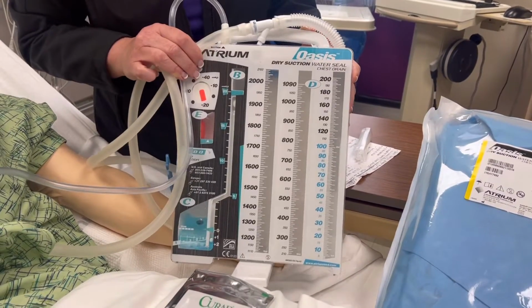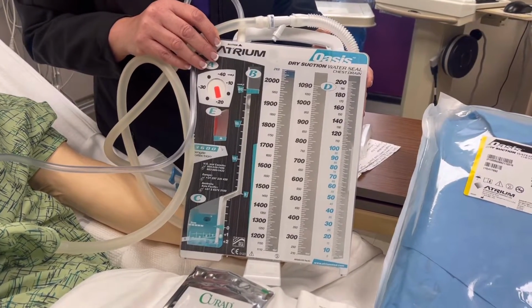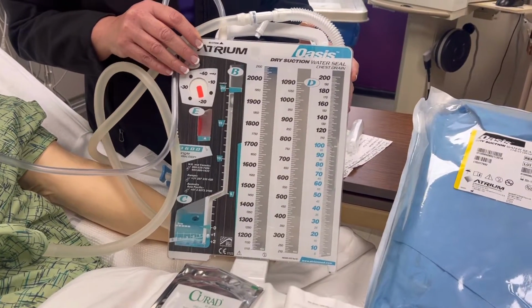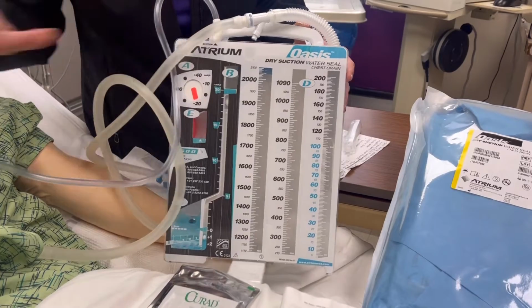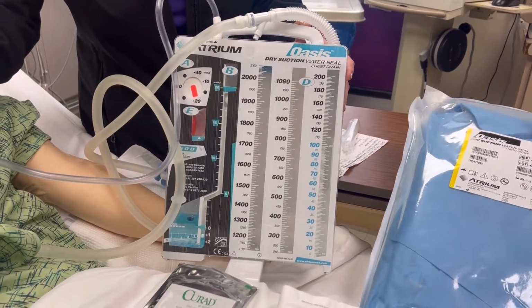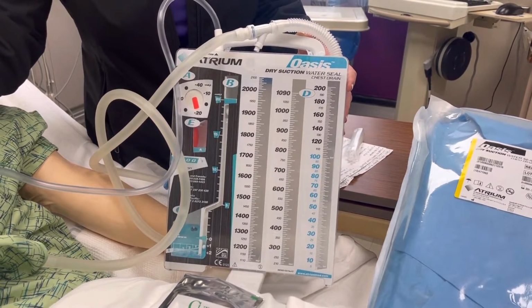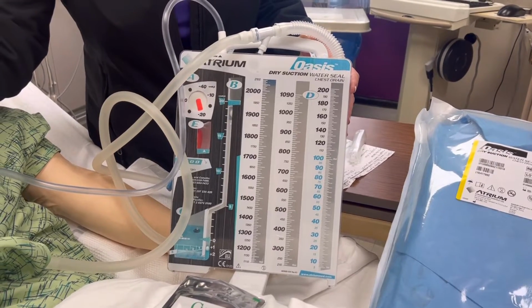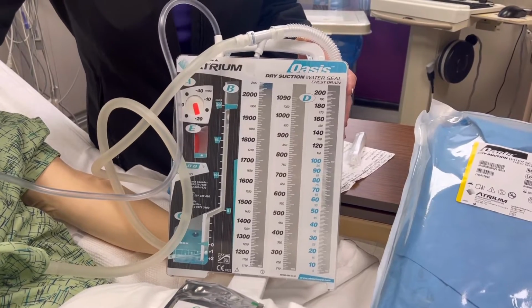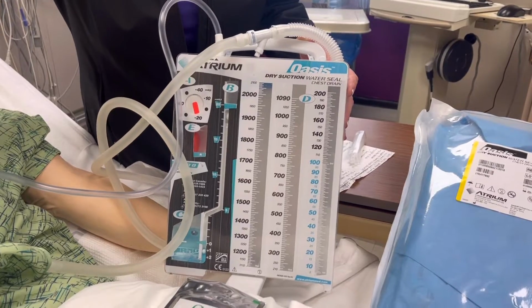The output on your chest tube should be documented at least every 4 hours on the med-surg unit and every hour in critical care. You'll need to add the avatar for the chest tube on your patient in Epic. Once you add the avatar, it will automatically link it to the in and out flow sheet, where not only you will be able to document your output, you will also be able to document your assessment. You should be looking at your site. Is it clean? Is it dry? Is it intact? Is my dressing clean, dry, and intact? Did I have to change it?